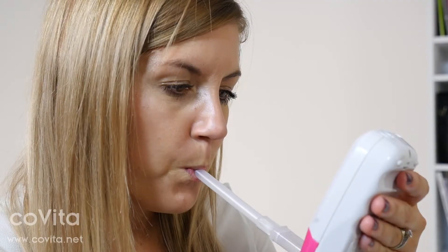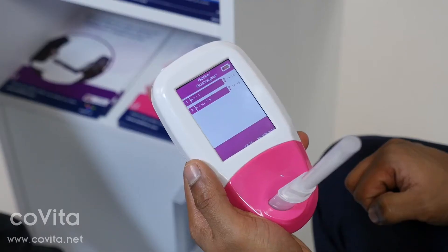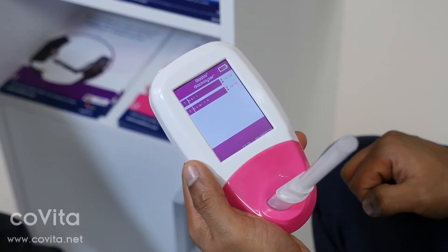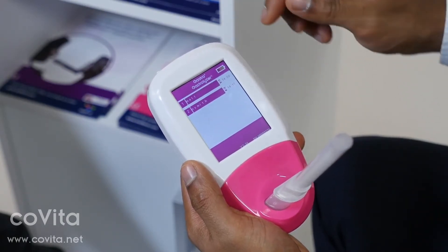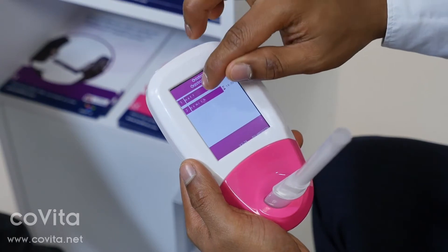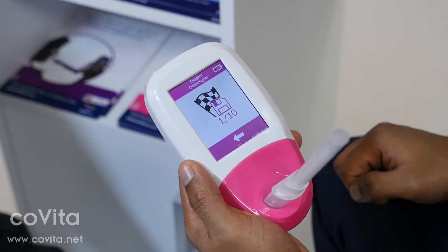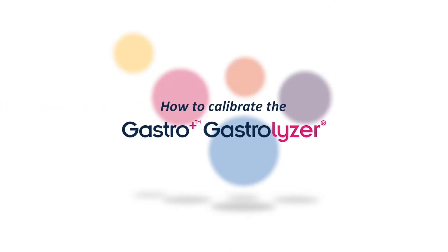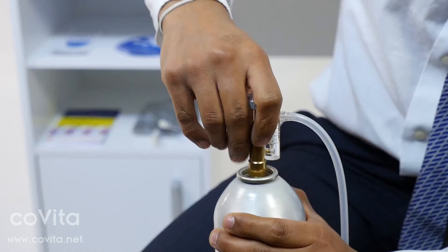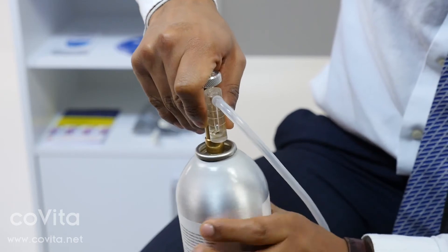You will then be on the profile for the next patient. Click on the breath test icon and repeat the process. If you need to finish a patient's test early, once you are in the protocol countdown screen, click on their name and click the save icon to confirm. To start calibration, click Settings and then the calibration icon.